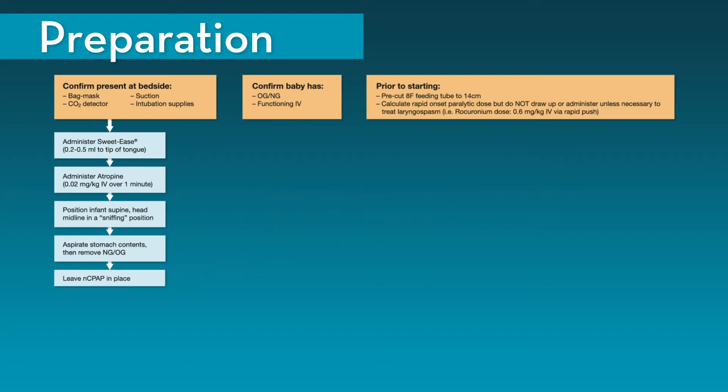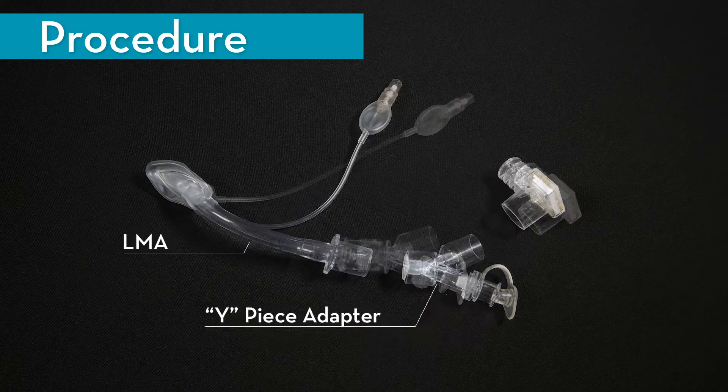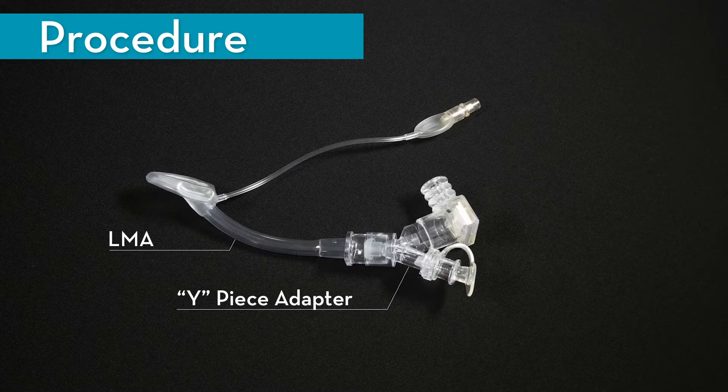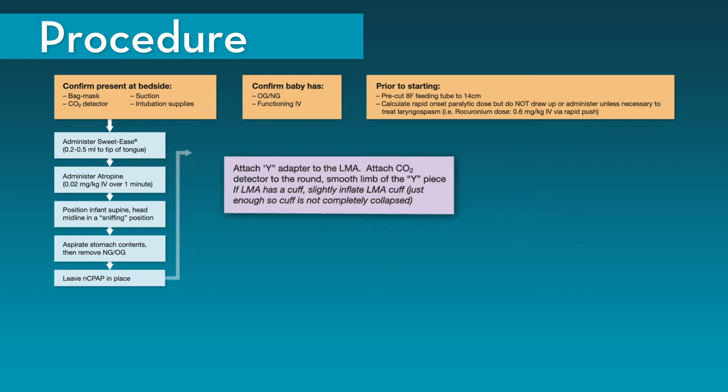The next step in the procedure is to insert the LMA. First, prepare the LMA by attaching the Y-piece adapter to the LMA and the CO2 detector to the round smooth limb of the Y-piece. If the LMA you are using has a cuff, slightly inflate the cuff just enough so that the cuff is not completely collapsed — this will help prevent the cuff from folding over on itself during the insertion process.